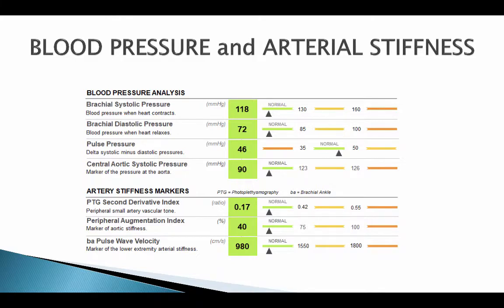The first component of the test is blood pressure. This is a young, healthy person with a blood pressure of 118 over 72 — very normal. It also gives you an indication of the pressure in the aorta.